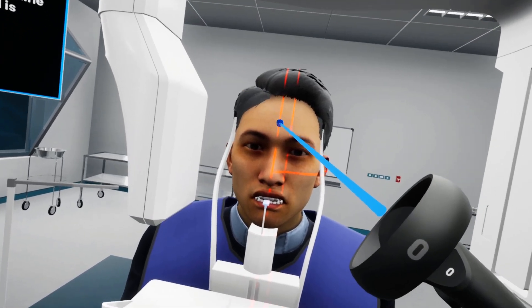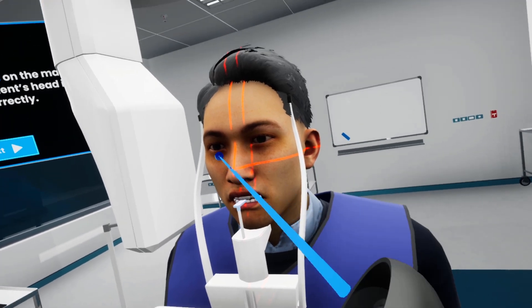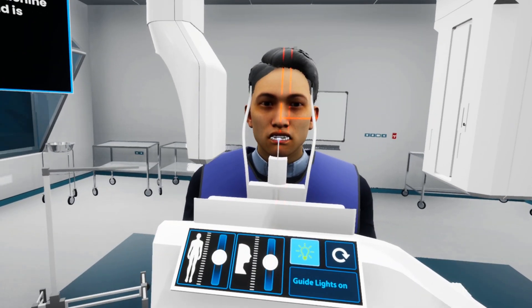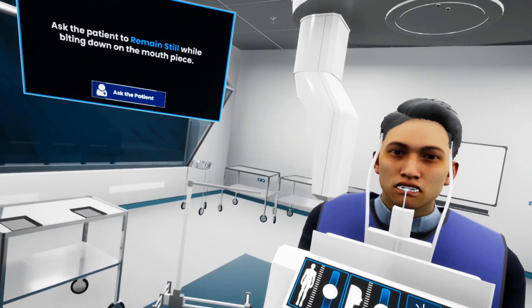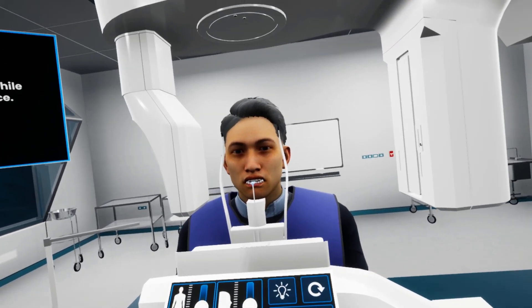We need to make sure that the first vertical line crosses the face from the middle, and the second vertical line passes the canine. We also need to make sure that the horizontal line crosses the nose bridge perpendicularly. You can adjust the patient's head during this step to ensure that the lights are in the right place, and once we are done, we can turn the guiding lights back off.